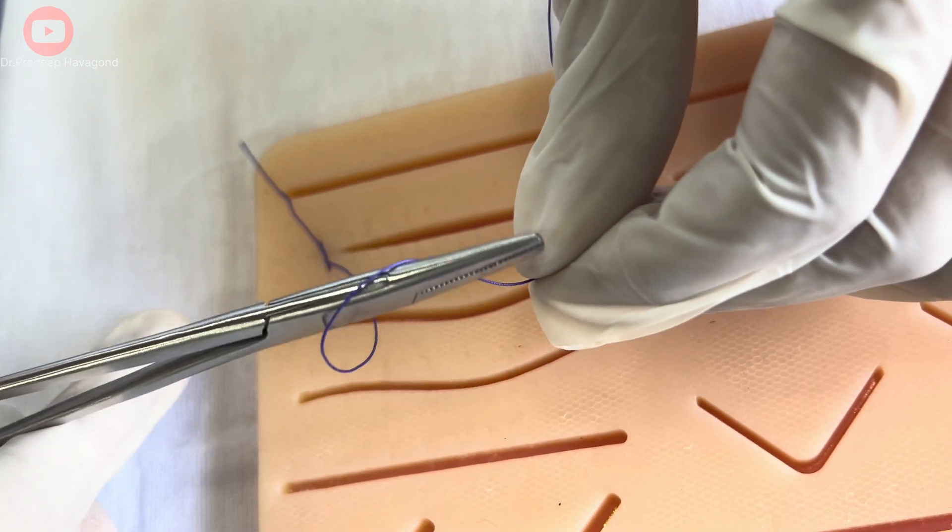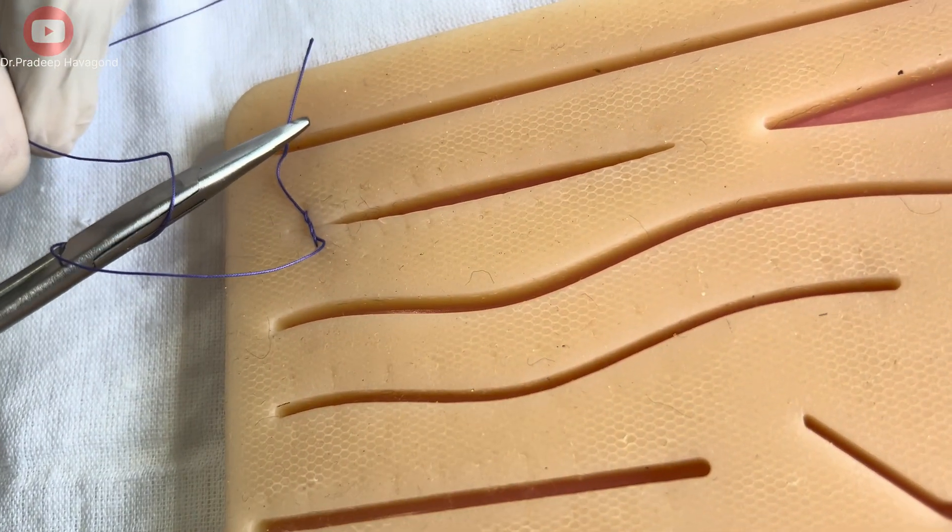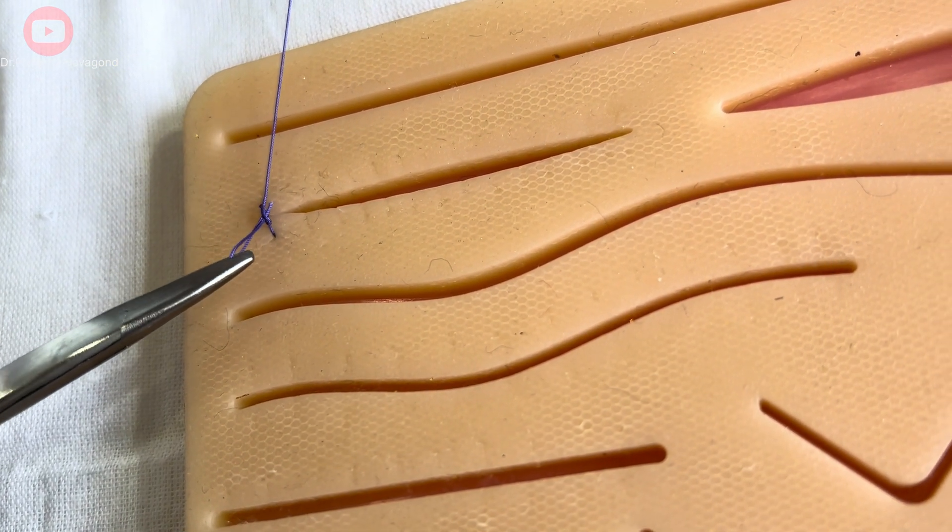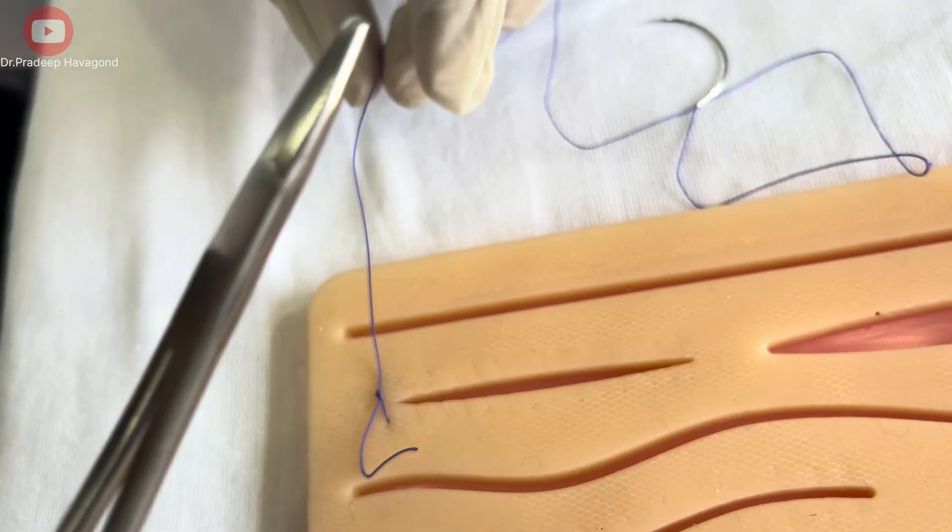Now, to secure the suture, we will tie a square knot. This is done by making two throws, one in each direction. Start by crossing the ends of the suture, then repeat in the opposite direction.